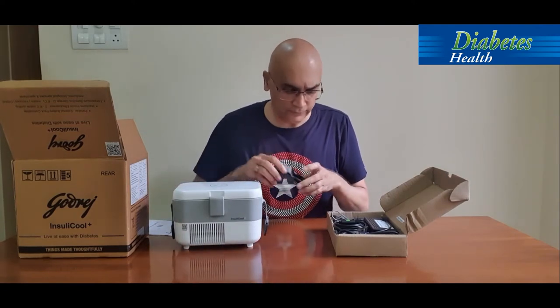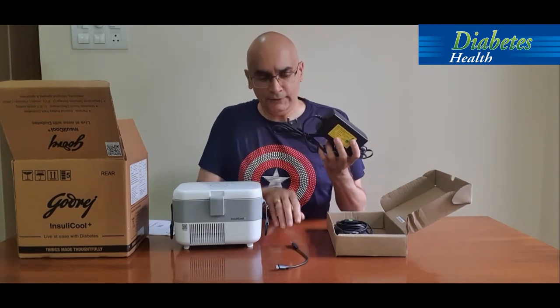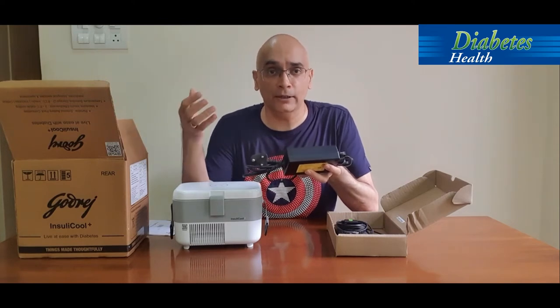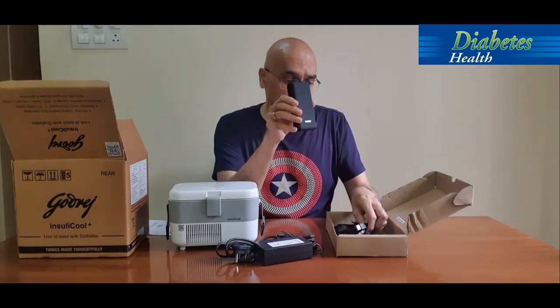They've also provided a charger and an adapter. This unit needs to be cooled and charged all the time, so it needs a power outlet. If you have an inverter at home, you can't normally connect a refrigerator to it, but this unit can be safely connected to the inverter, giving you a consistent power supply during power cuts.